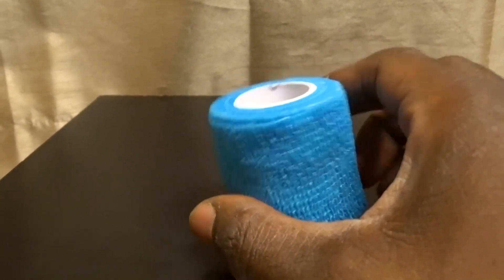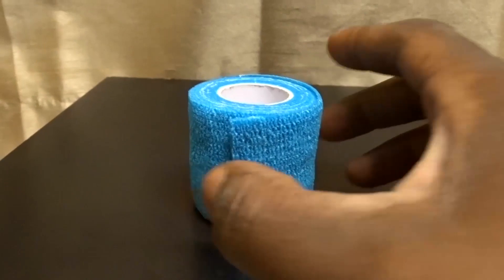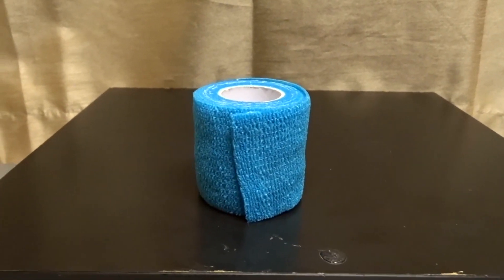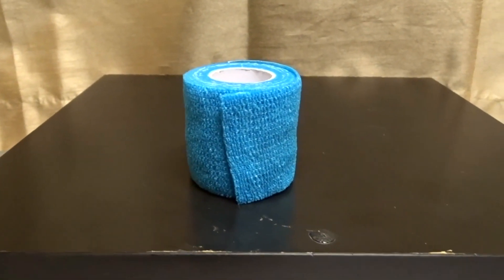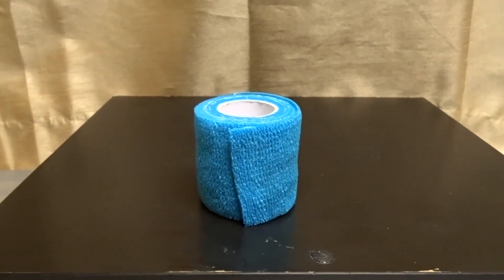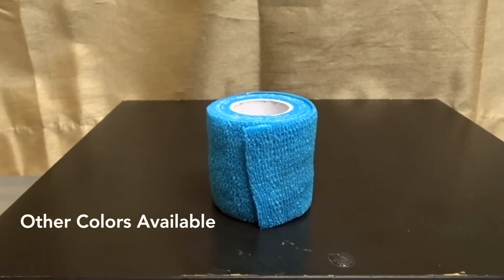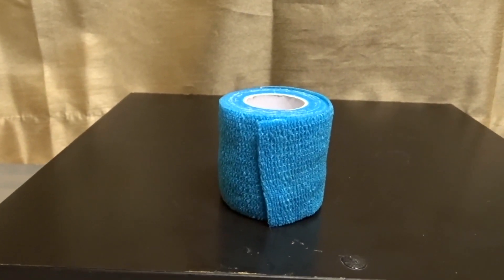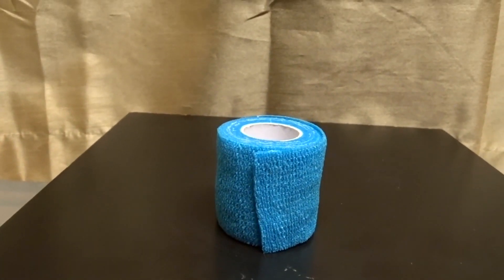It's cool because it comes in lots of different colors — playful colors. There's pink, blue, red, and green; you can get it in all different colors. Especially if you have kids and they get little scrapes and bruises every now and then, you might want to wrap something up and they can choose a color. It's pretty cool.